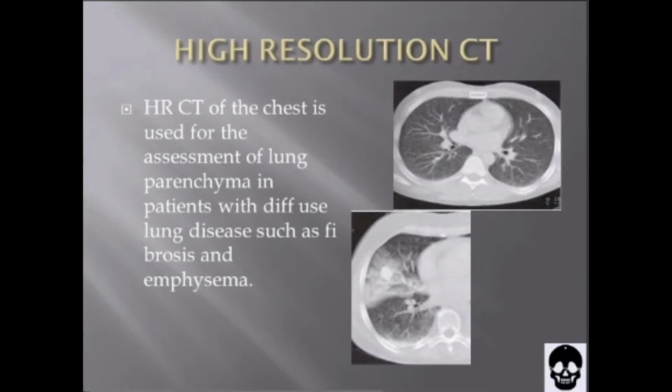Like airway imaging, high-resolution CT protocols use thin sections of 1.5 mm or less, a fast acquisition to reduce motion artifacts, and optimal spatial resolution. In addition to the thin sections, spatial resolution is optimized by the selection of an edge-enhancing algorithm, such as a bone algorithm, and a display field of view that is just large enough to include the lungs.